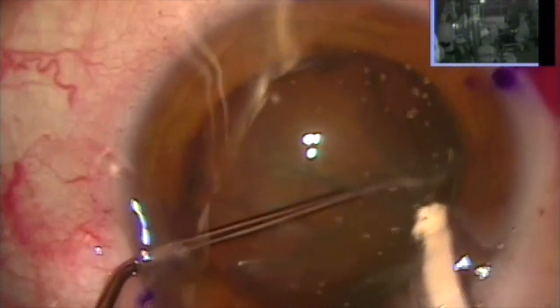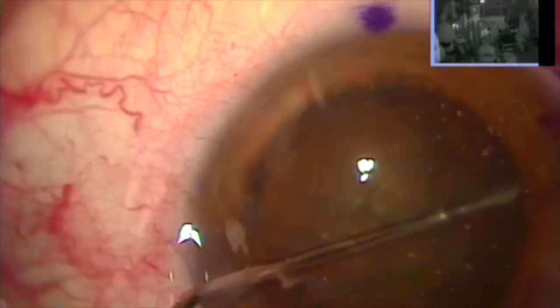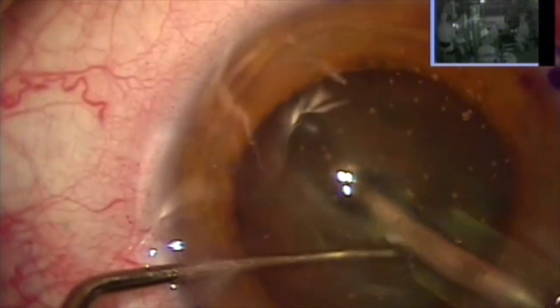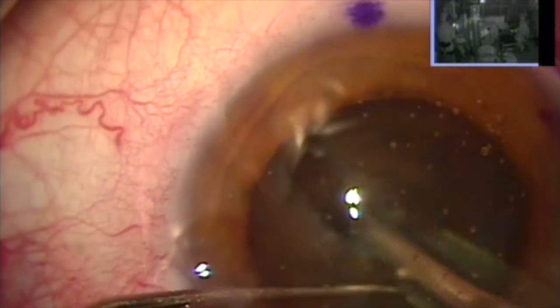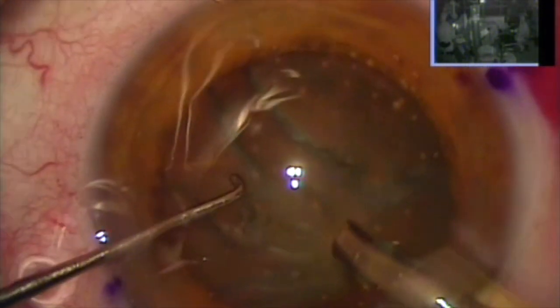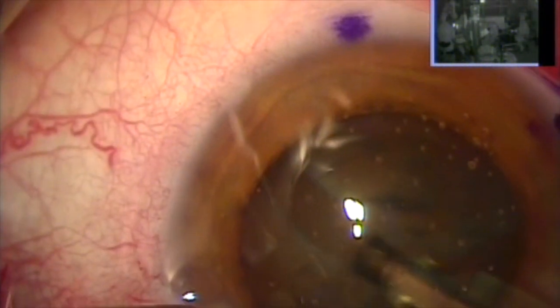I'm using a 13-millimeter tension ring instead of 12 because I want maximum stability of the periphery of the capsule. Here I'm injecting with the help of the Kuglen hook the ring under the anterior capsule, very carefully. And I'm stabilizing with my Sinski hook here to keep the lens from moving too much, but you can see how the whole lens-capsule system moves.